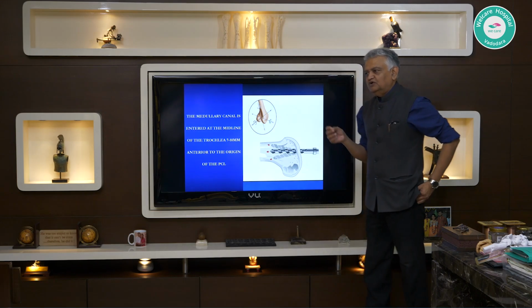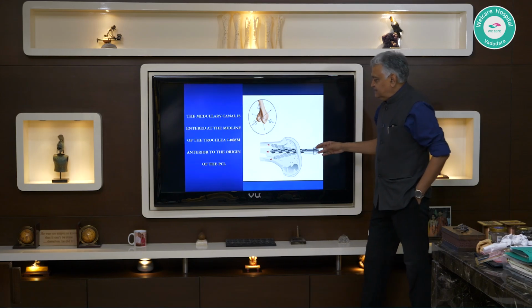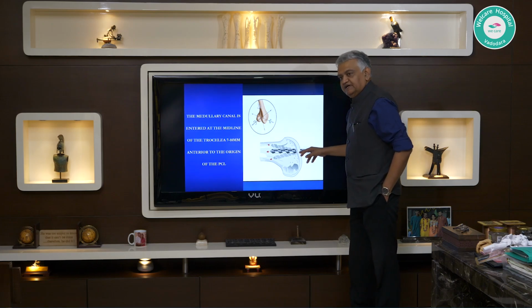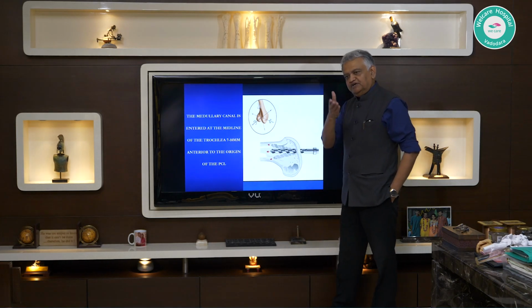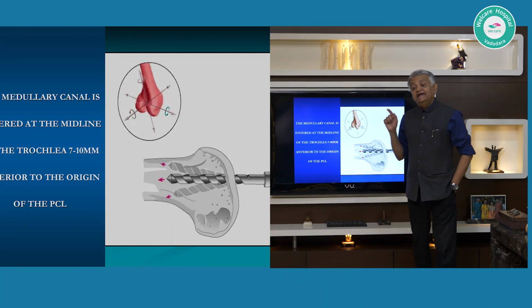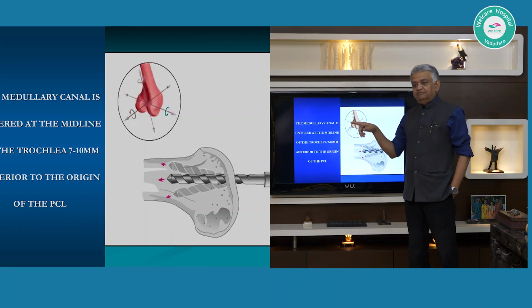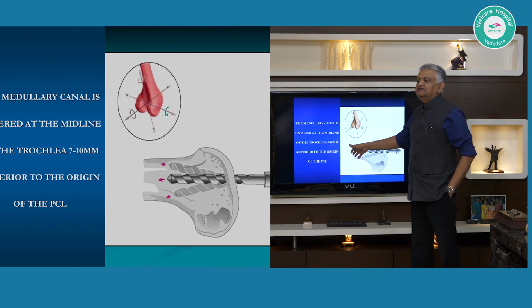So this is a small but very important aspect, not only to answer your question, that once you have done that and then when you push your intramedullary rod in, now the cortices will make sure that it goes in between the two cortices, and when you push it long enough and deep enough inside, then it will automatically catch the anatomical orientation of the medullary shaft, of the shaft of the femur.